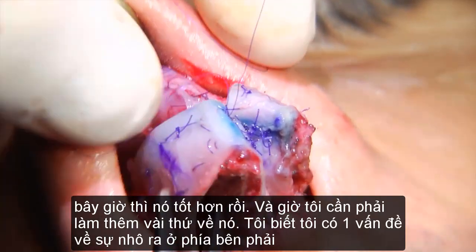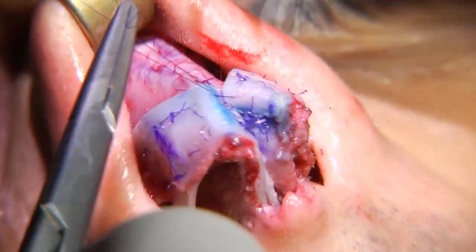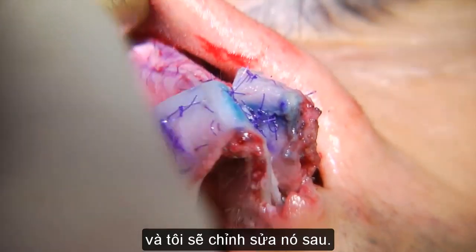Now it's better, and then we'll do something about this. I know I have a problem of the convexity on the right, but I will do something for it.